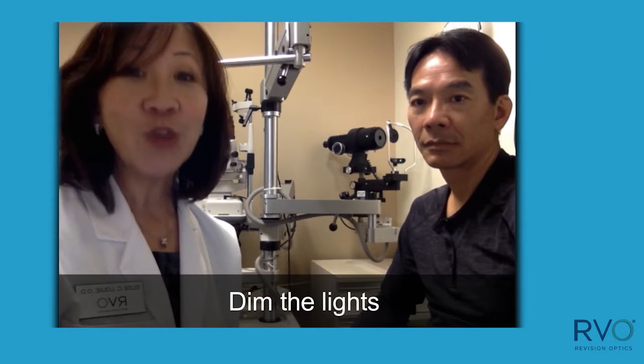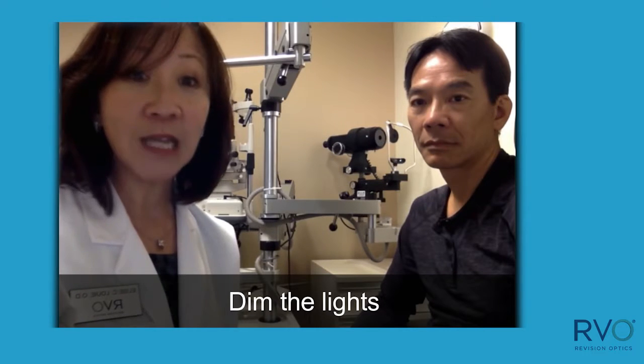There are two very important concepts to remember before you begin. First, dim the room lights as much as possible because pupil size makes a difference in the results. The raindrop inlay is centered over the light-constricted pupil, and it's through the center that the greatest steepening and refractive change occurs. If the pupil is too small, you may inadvertently over-minus the patient. Similarly, all refractors typically over-minus patients as well. So turn down the lights.